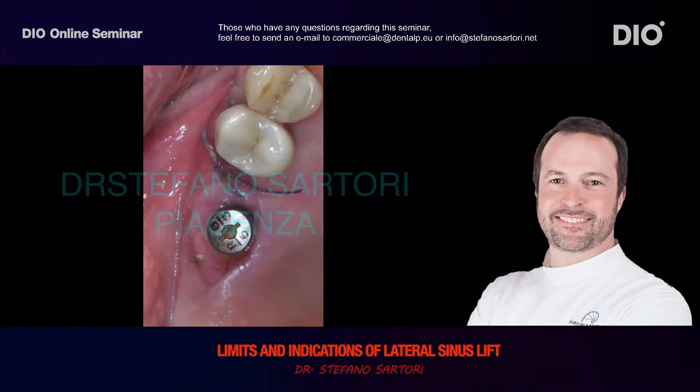After 1 week of healing, I can appreciate the presence of 2-3 millimeters of keratinized tissue. This is very important, especially to increase the compliance for the patient in the oral hygiene. For the daily oral hygiene is very important. It's much more easy, it's much more comfortable, the oral hygiene, if I have just a little piece of keratinized tissue.